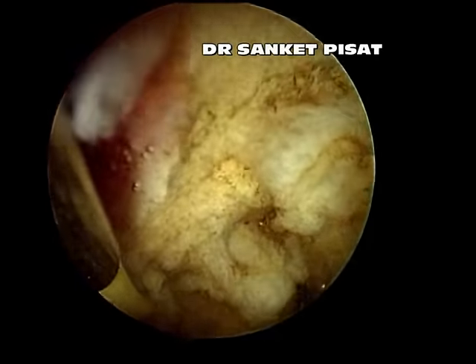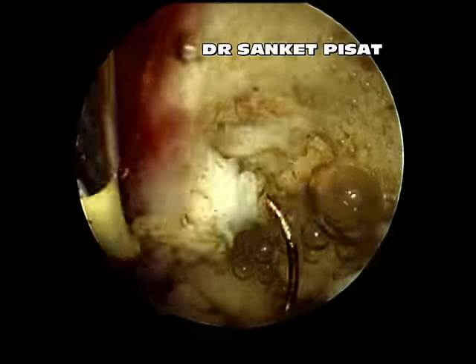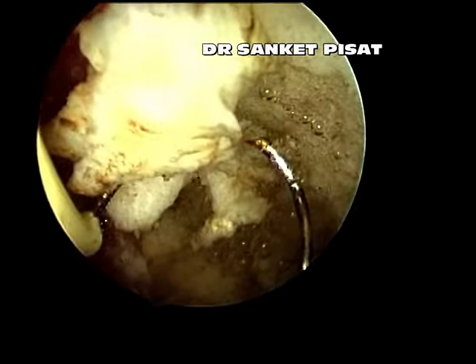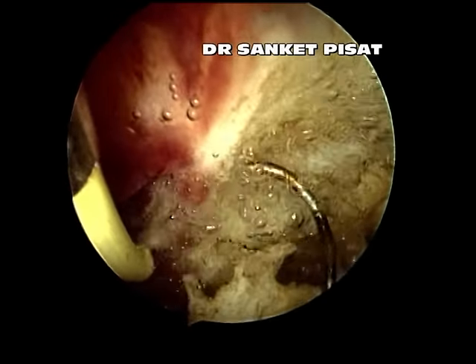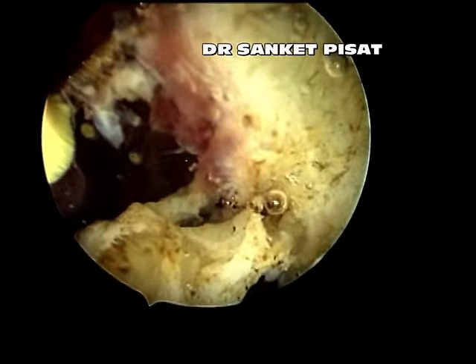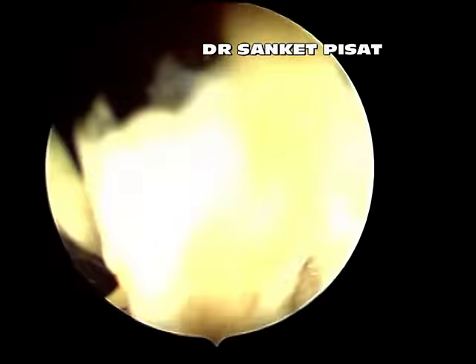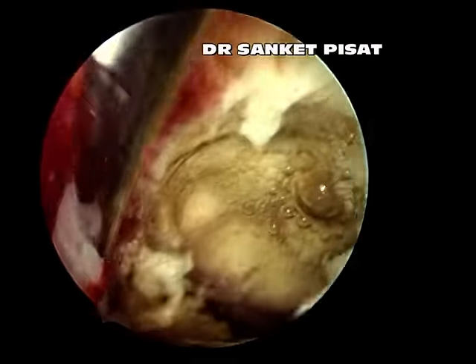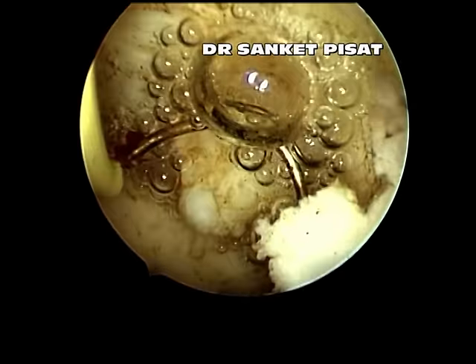Again, it must be specifically emphasized that these maneuvers can only be attempted once the surgeon has mastered the conventional resection technique. The beginner must fully understand that activating an electrode and pushing it towards the fundus will lead to perforation of the uterus. Also, the current may be transmitted to adjacent abdominal organs like the intestines or the urinary bladder, and therefore utmost care is needed in order to avoid perforation.